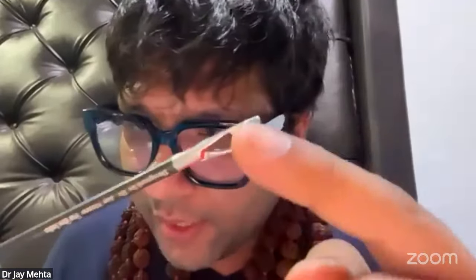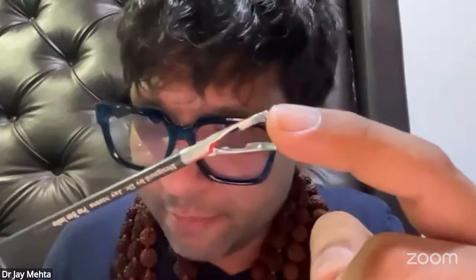I'm showing it in front of my glasses. Okay, if you see, this is a bipolar device. So what does it have? It has one pole and the other pole. So the current passes from one pole to the other pole. Very simple. What comes in between these two is the tissue.